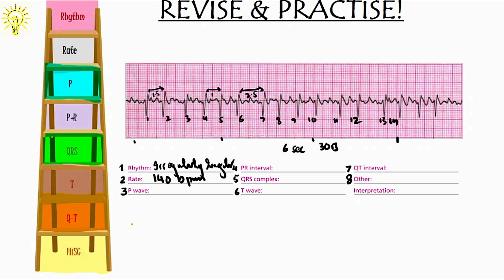Can you see any P wave? I can't see any P wave. These are fibrillatory waves. So, no P wave is seen. PR interval: Since no P wave is seen, we cannot comment. The QRS seems narrow. If you calculate between these two, it's barely two small boxes. So, almost 0.08 seconds, which is normal. This means that the impulse is being traveled through the normal pathway. The T wave, I cannot discern the T wave. So, I cannot comment here. The QT interval, of course, the T wave is not discernible. So, the final interpretation from this ECG, irregularly irregular fibrillatory waves is AF or atrial fibrillation.